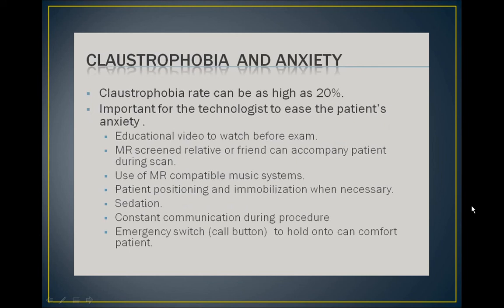Music can be used to calm a patient and protect them from acoustic noise. They may also be allowed to have their favorite CD played if they choose. Some patients do better prone or feet first instead of head first. Some people find it helpful if they don't see the inside of the magnet. A blindfold or washcloth over their eyes can help considerably. Diazepam or other anti-anxiety medication can help patients get through the procedure. Using these usually requires written consent by the radiologist, and a driver must accompany the patient to their exam.